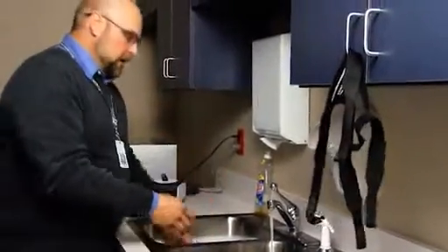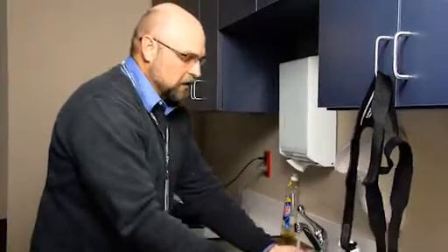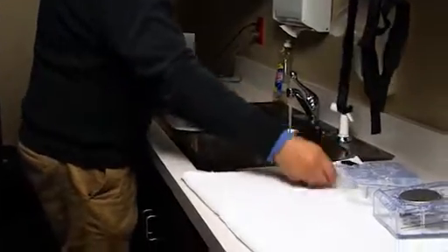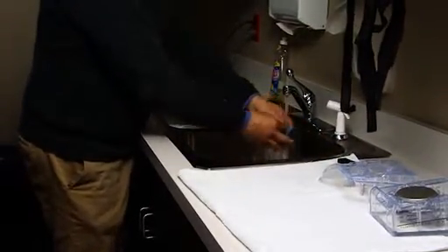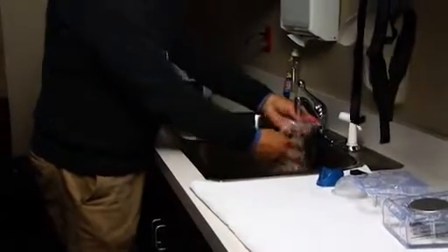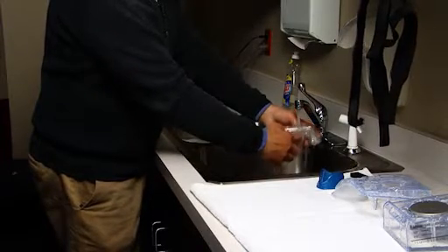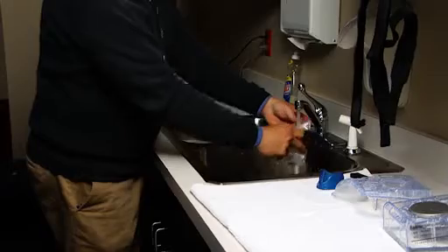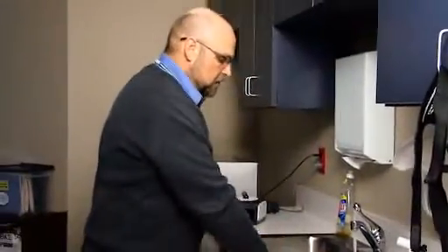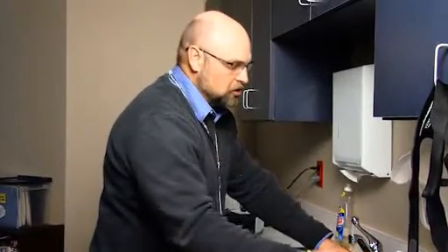It's recommended to do the maintenance in the morning, just because you want everything nice and dry by the time you put it on your face. Otherwise that can be rather unpleasant also, but you just want to dry it out and rinse it off. It dries a lot better if you disassemble it as much as you possibly can, but you can dip it out, and it just takes a little longer to dry.